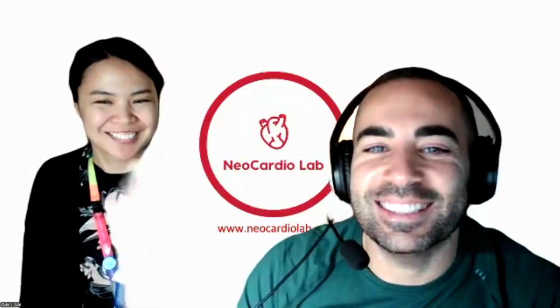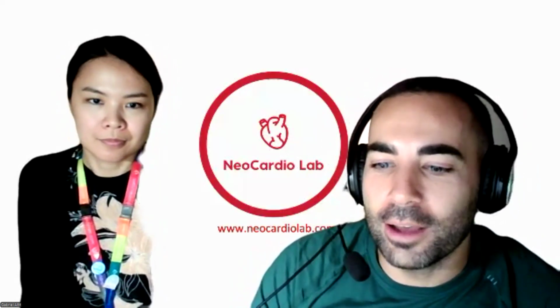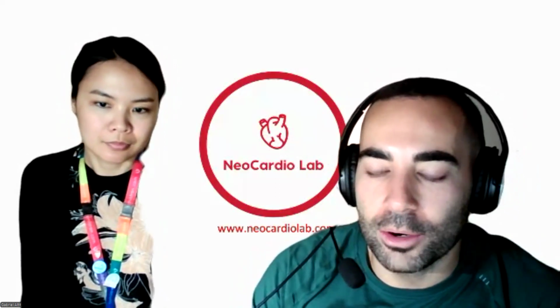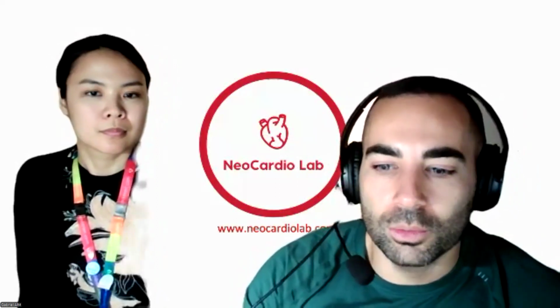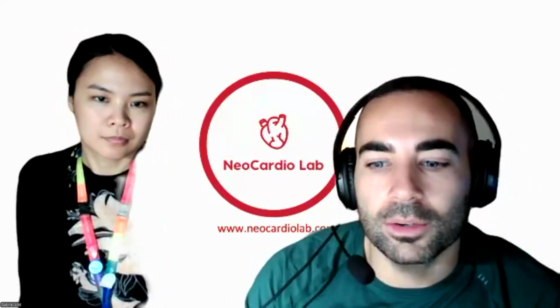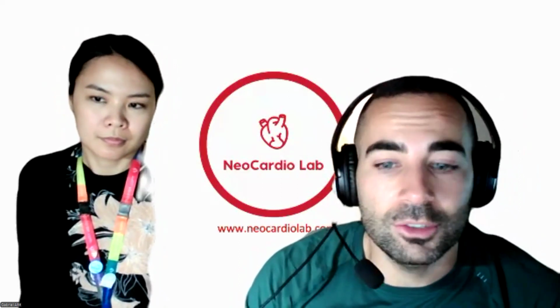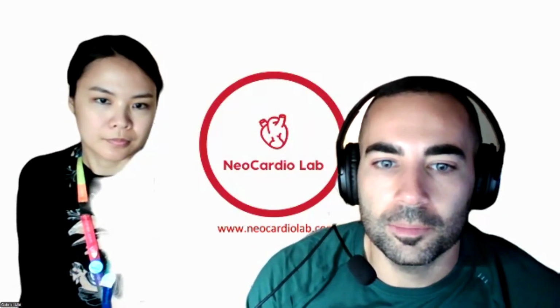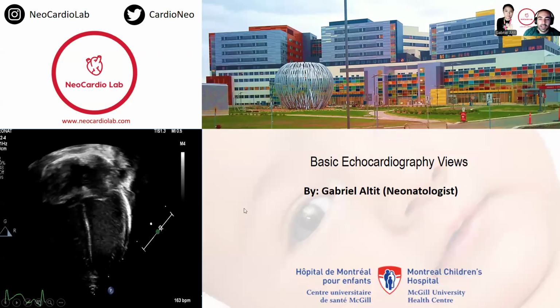I'm a neonatologist at the Montreal Children's Hospital, and I am here today with Dr. Surya Sahatsarungsi, who is a fellow in neonatal hemodynamics at McGill University, and together we have prepared some slides regarding basic cardiac point of care ultrasound. These slides are meant for pre-conference workshops in order to prepare some of the material before coming in for some of the hands-on stations. So I will be sharing my slides.